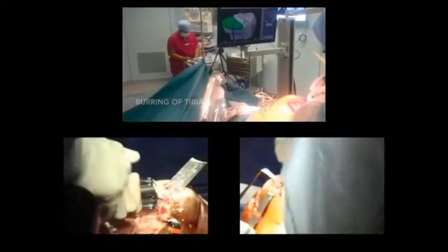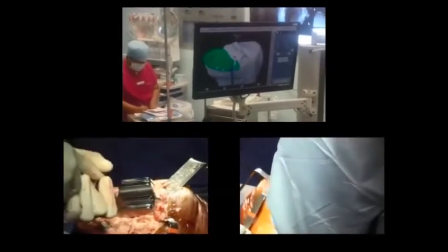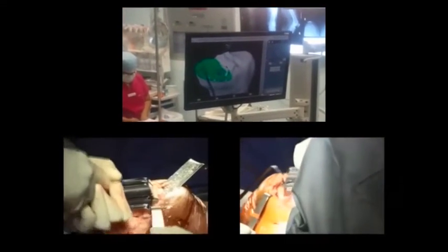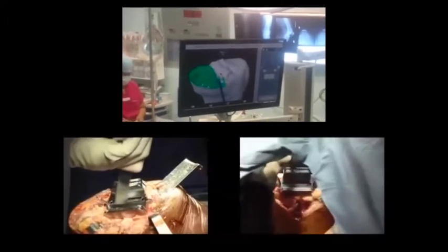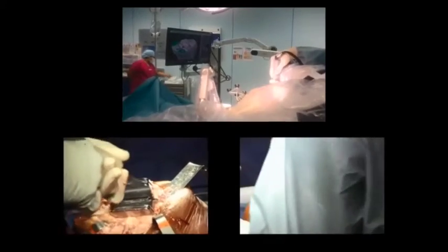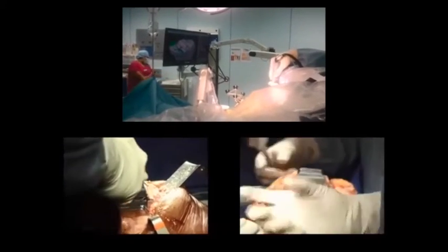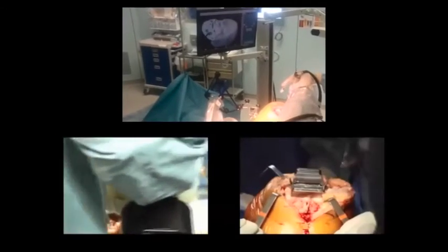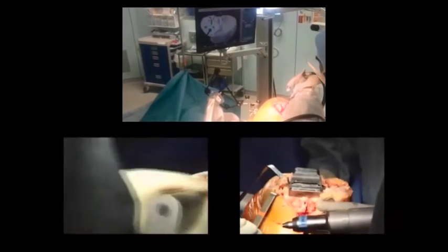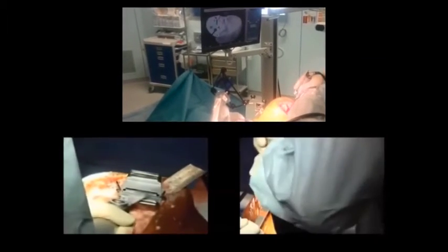On the top I'm beginning to burr the tibia, and you can see the technique used is really not a cut — it's more of a milling or grinding or burring process where we take off bits of bone very superficially to deep. You can see that results in minimal bleeding. Most of these patients do not require blood transfusions, whereas in traditional knee replacements a fair amount of blood loss occurs and you do have to transfuse a fair number of these patients.